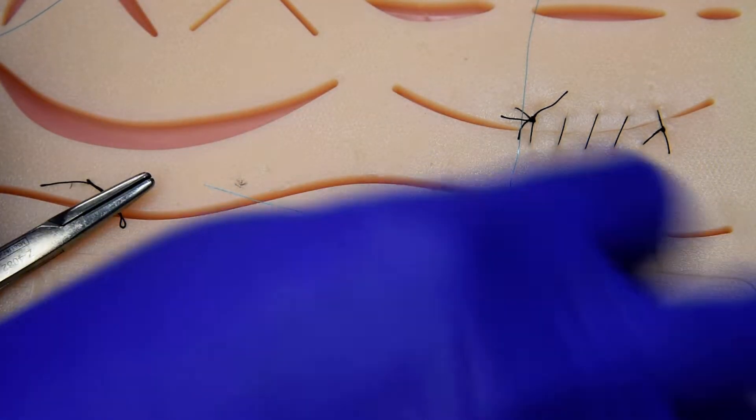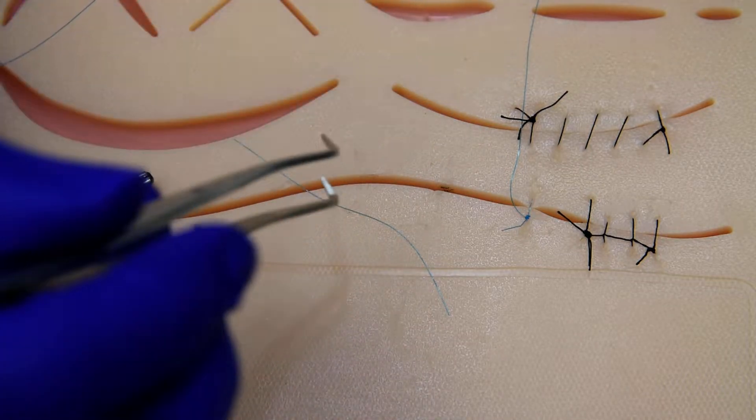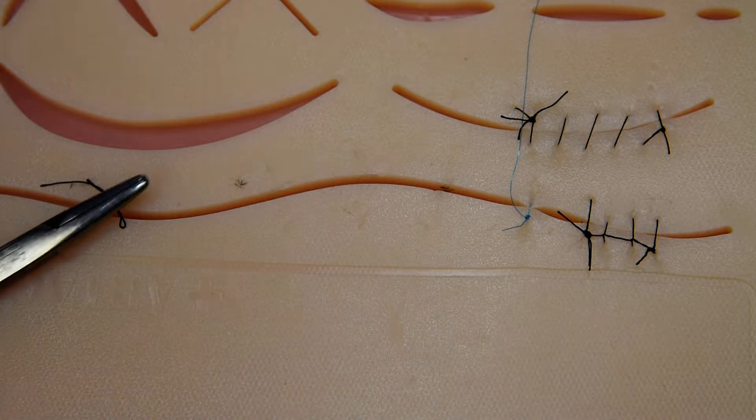We'll cut that tail and, just like we did on the other two examples, we'll move forward with three to four millimeter bites, three to four millimeters apart.